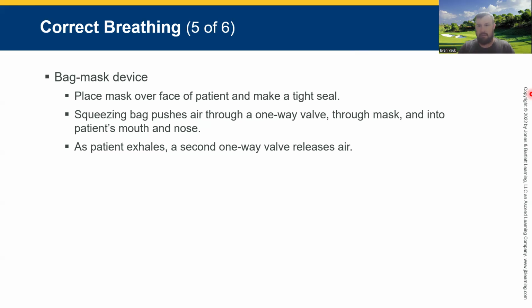I don't know the exact numbers. I know that other people know them, but I don't off the top of my head. We are not just compressing that bag all the way. We're not just hammering down on these people. It's about a quarter to half, and we're going to give that breath. If we're just doing rescue breaths, we're going to give that breath once every 5 to 6 seconds.